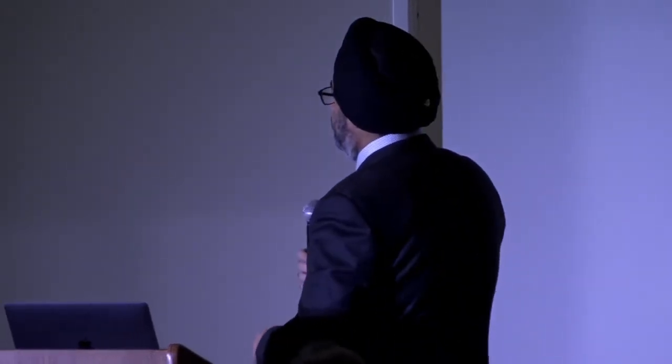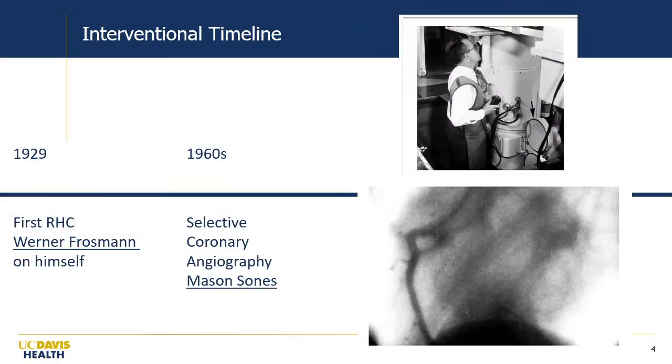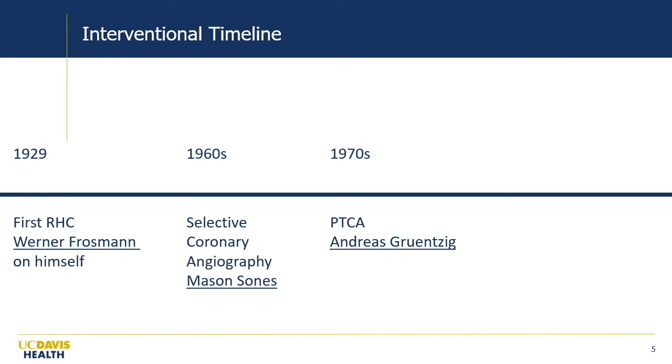And then, these are the earlier images from the work that he did in developing coronary angiography. This is the right coronary artery, and this is what the old X-ray tube looked like. What we have in the cath labs today is nothing compared to what it used to be. And then obviously the birth of coronary interventions was Dr. Gruntzig, who looked at taking catheters and wires into the heart and doing balloon angioplasty.